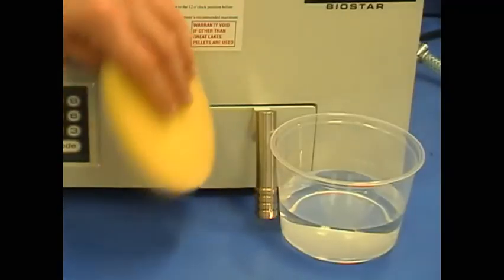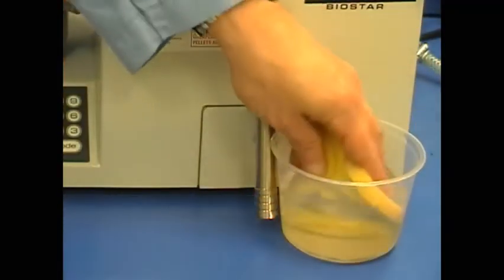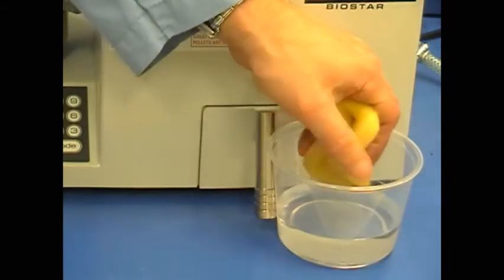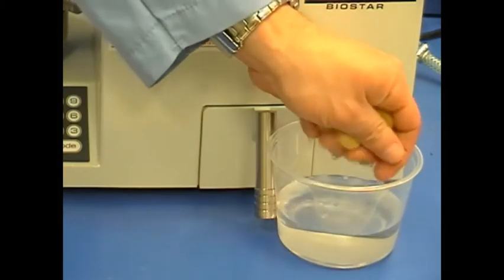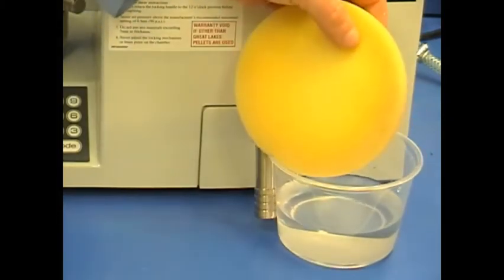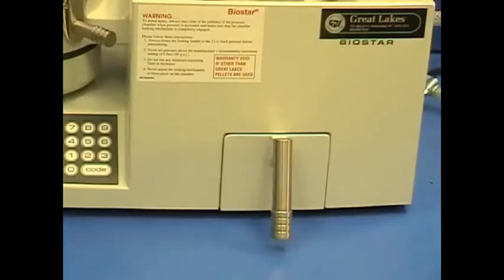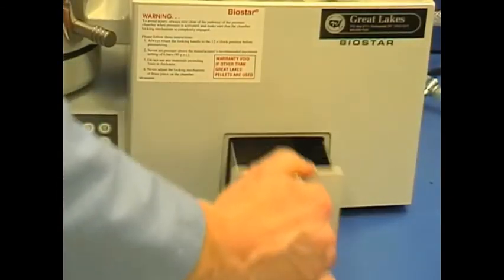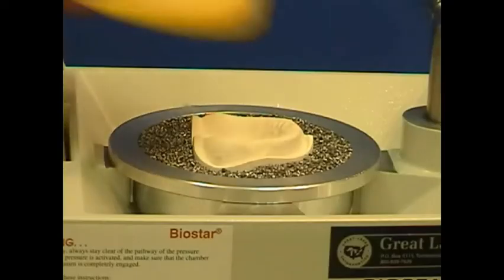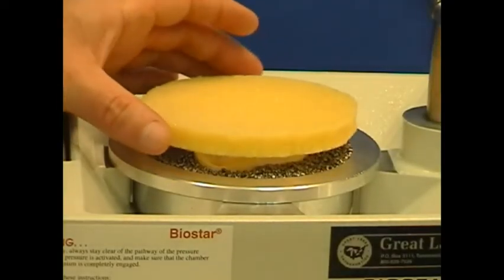The spacer foam is moistened with water, which will allow it to be easily removed from the formed blue heavyweight material. Squeeze out excess water from the spacer foam material. Remove the BioStar pellet drawer for this application, as excess moisture within the spacer foam could flow into the drawer. Center the spacer foam over the model in the pellet cup.